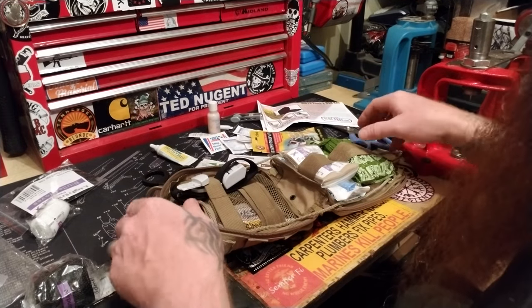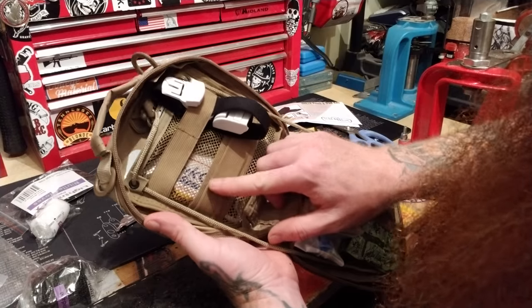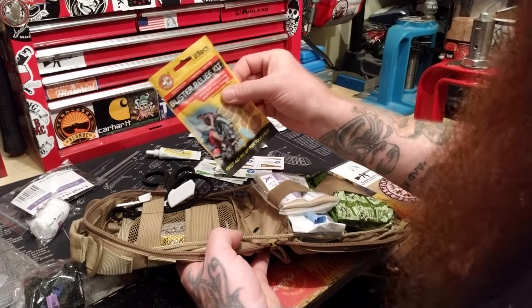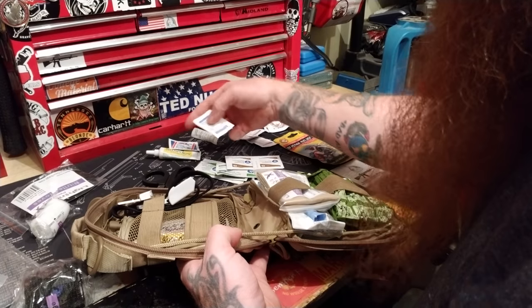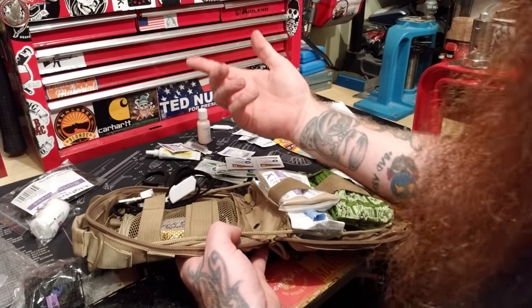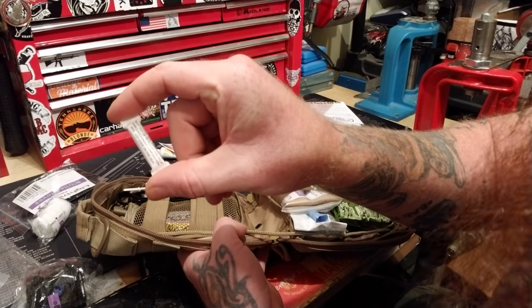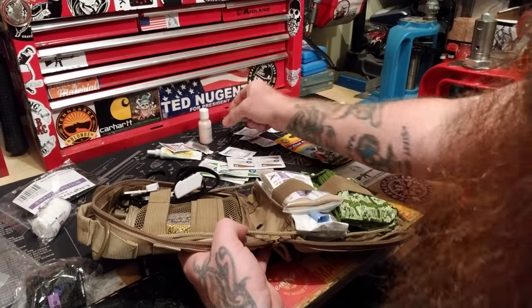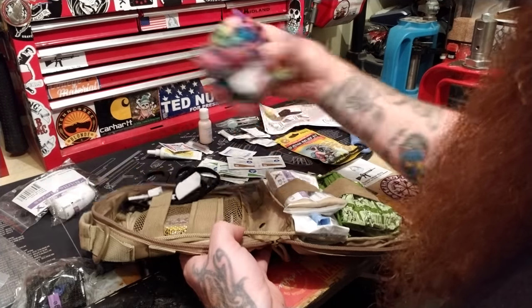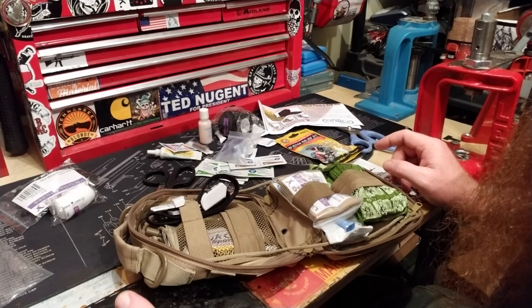Before finishing assembly, here are the main components plus additions: QuickClot, Neosporin, blister relief pads, sting relief, iodine, calamine for poison oak or bug bites, ammonia inhalants to wake someone up, tweezers, a cuddle buddy for stress relief, and non-aspirin pain reliever. Less stress, less blood.